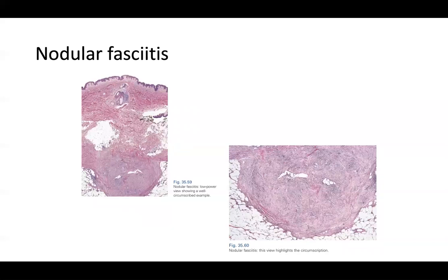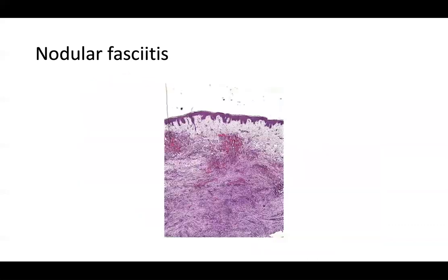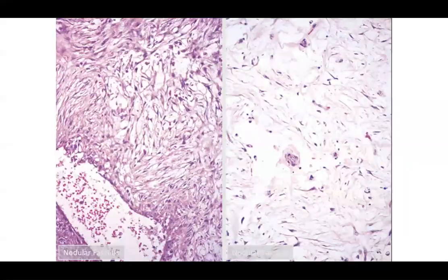study it. I would definitely do immunohistochemical stains to make sure you're not dealing with muscle-derived neoplasms, but you can definitely have positivity for SMA in nodular fasciitis, so that doesn't really help a ton. I find these to be very easy to make sure that a desmin stain is negative. So that's always helpful, just to do a desmin and make sure it's negative in these entities.